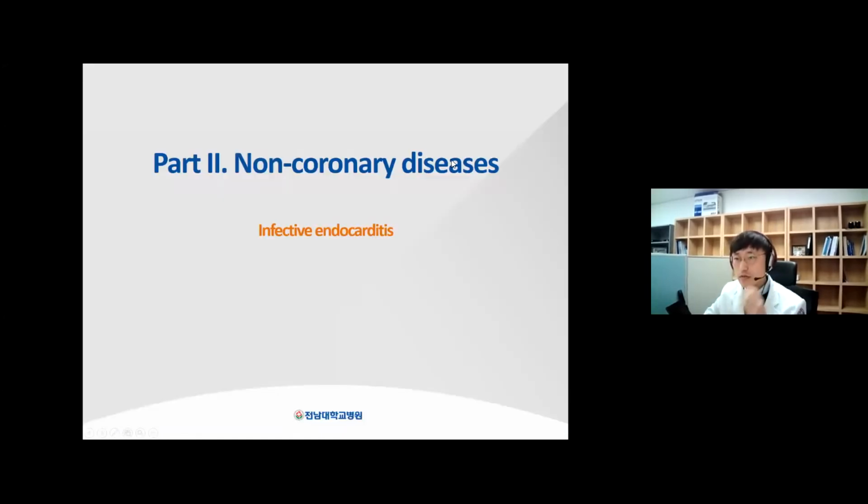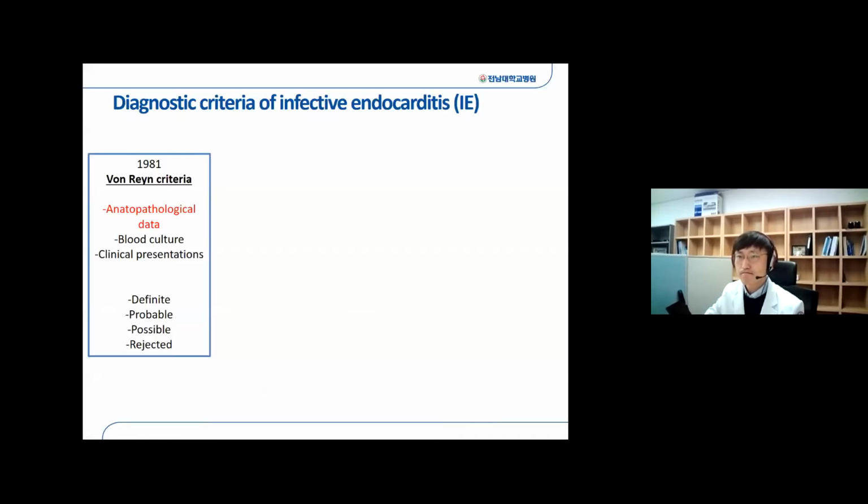Now we'll move on to the second part, non-coronary disease. And the first disease entity is infective endocarditis. Very interestingly, the diagnostic criteria in the history of infective endocarditis diagnosis have changed parallel to the developments in the imaging modality.